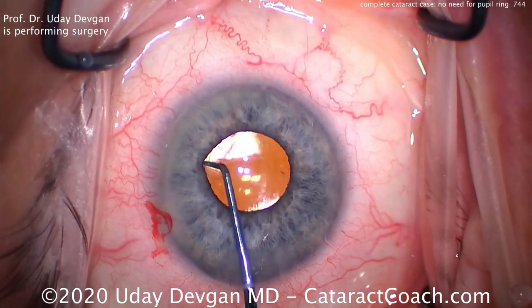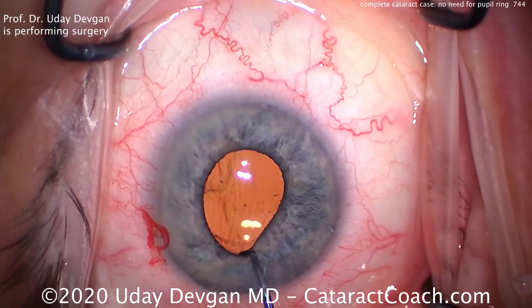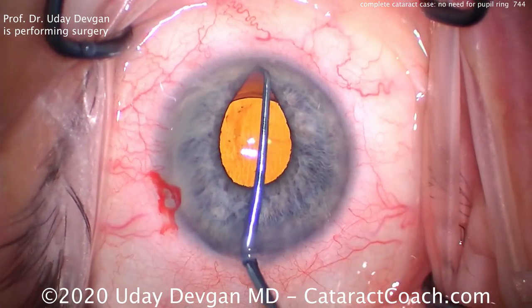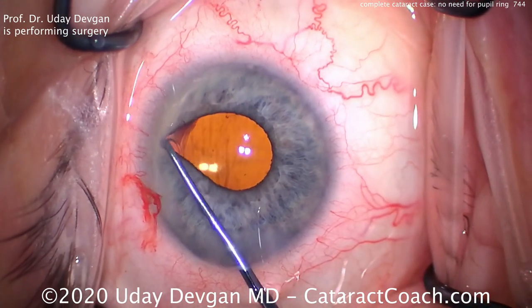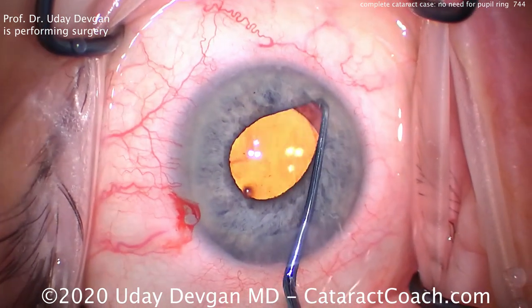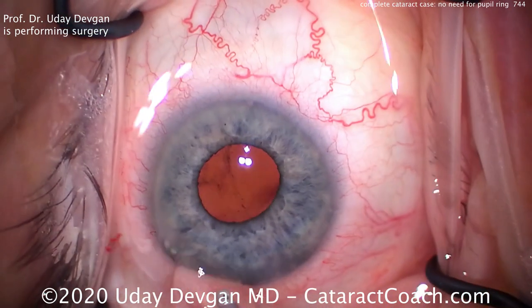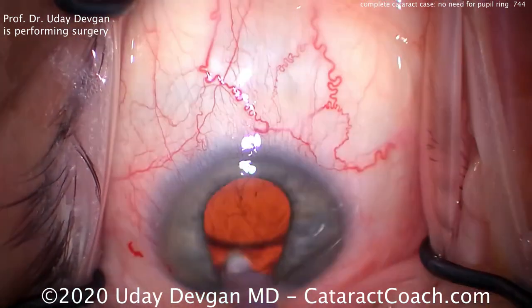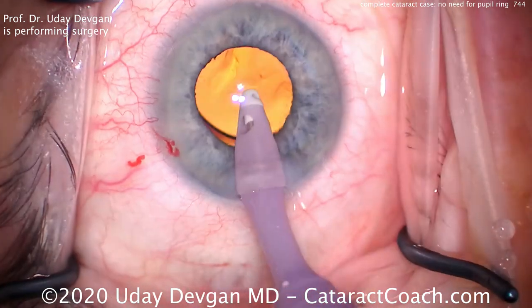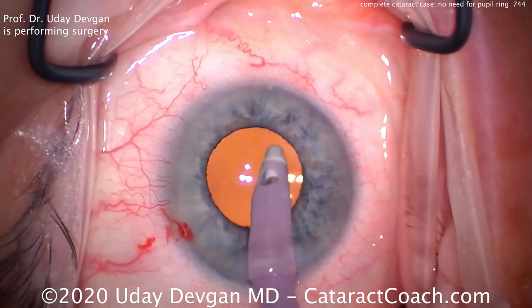Now the lens is beautifully centered. We've also rotated it so the haptics are at the patient's 12 and 6 o'clock positions. Sweeping around here, making sure there's no retained lens material — which is good. We can also see the optic is behind the capsulorhexis. Very important — you don't want to end up with this lens in the sulcus, that will pose many problems later. Never put a single piece acrylic lens in the sulcus — even half of the sulcus is not good. Now we'll take the IA probe and go behind the IOL optic to remove viscoelastic, lifting the optic up. That's also the reason why we want the haptics 90 degrees away from our main incision — it allows us easier access underneath the optic to remove that viscoelastic.